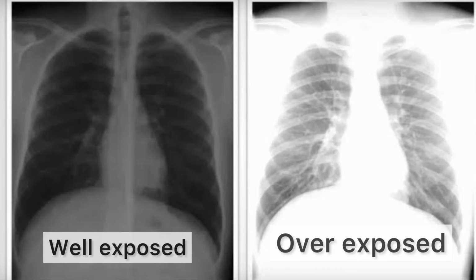So as a radiographer, you have to make sure that you know your exposure factors, which is your KVP and MAS, and that way you won't have to repeat because your pictures are not well exposed. So yeah, these are the things that you should put into consideration when you have your patient with you. Also, if you can cover up the sensitive areas close to the area of interest. So the area of interest, remember, is the organ that is affected, that is to be x-rayed.